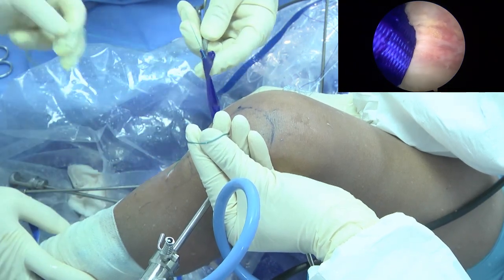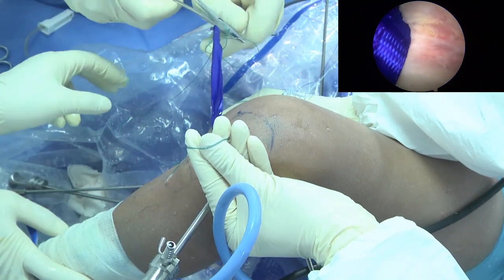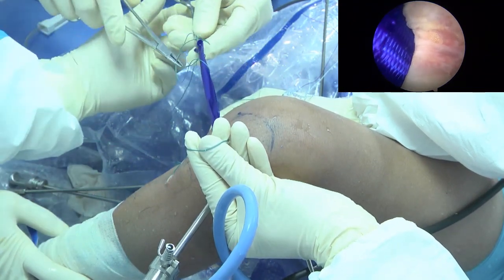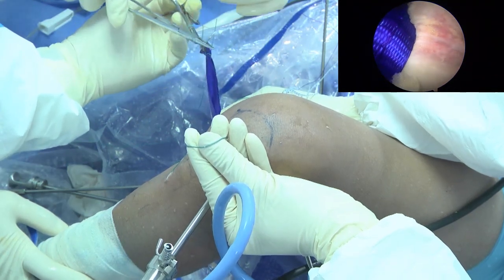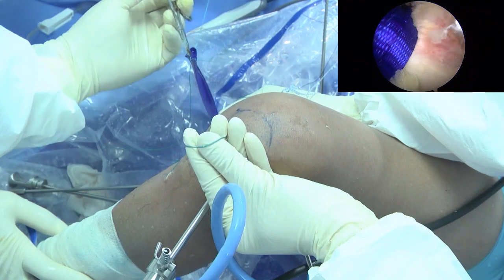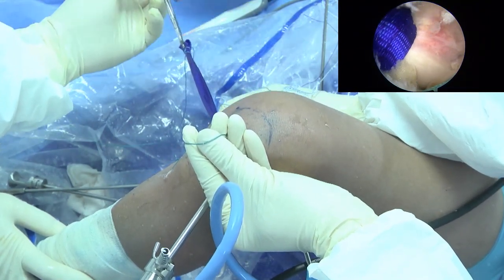You need the stronger sutures? Strong. I think we put two sutures, otherwise it can cut through. One more suture.